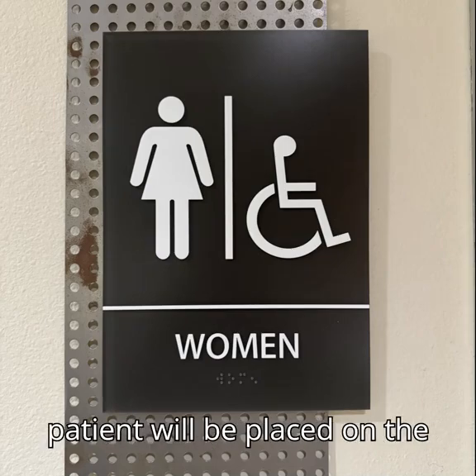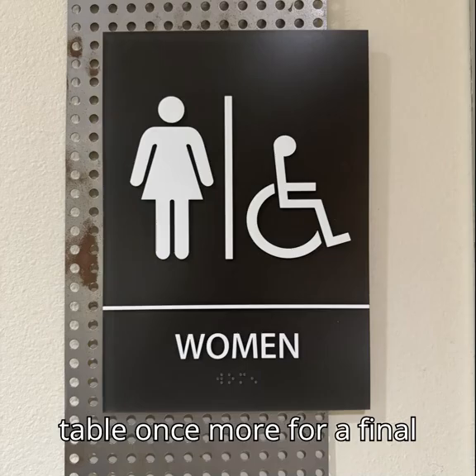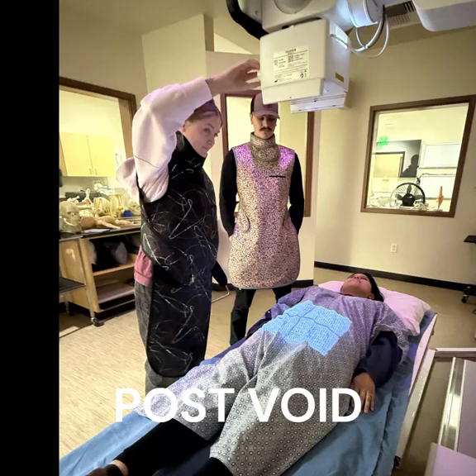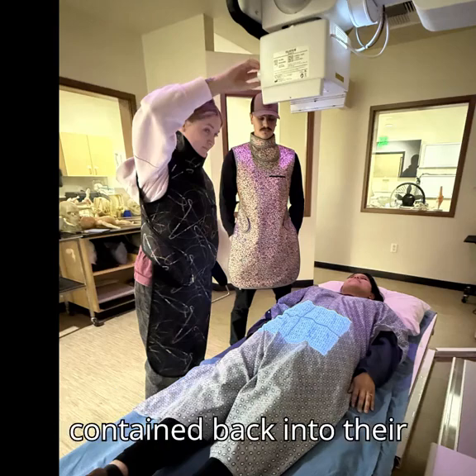The patient will be placed on the table once more for a final post-void image to assess for residual contrast. After this point, the patient can change back into their clothing and the exam is complete.